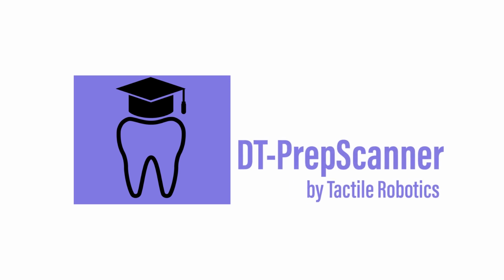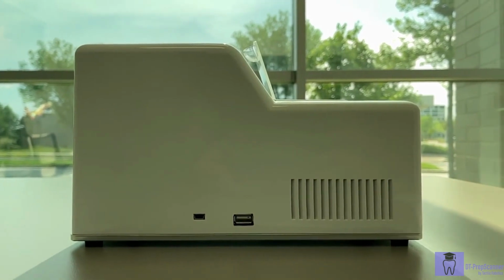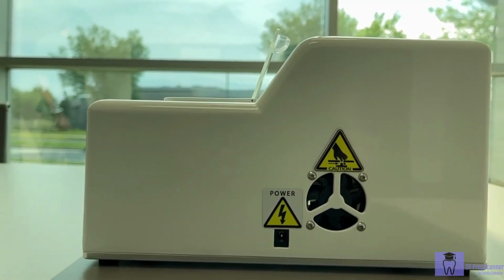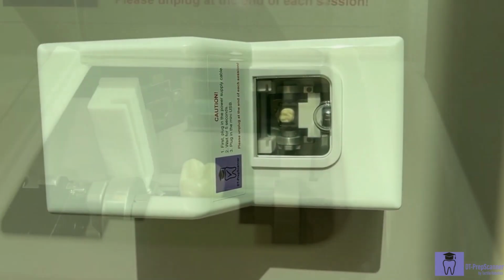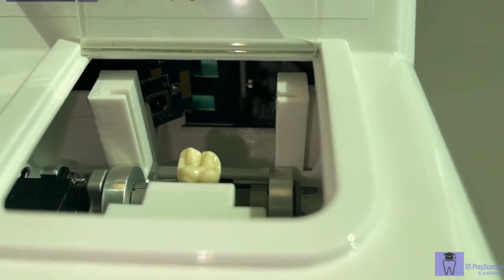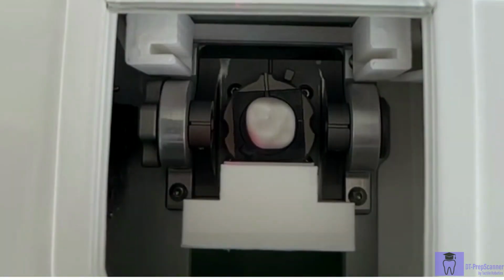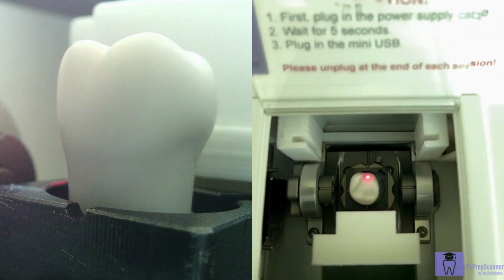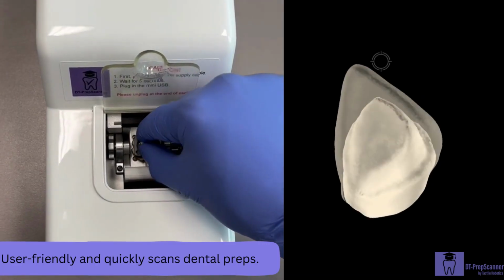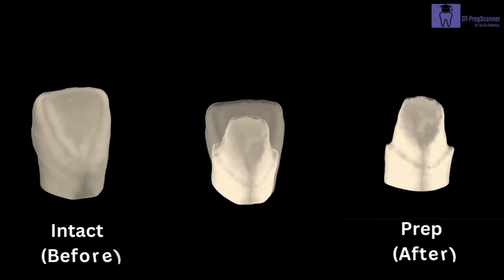Introducing a new technology in the field of dentistry, a fast, objective, and accurate way to grade students' dental prep. This compact and portable device eliminates the need for traditional measuring tools. It is an automated measuring device that employs robotics and laser sensing technology to scan 2D and 3D models of dental prep. The DT-PrepScanner stands as a formidable instrument for grading, measuring, and optimizing tooth preps.